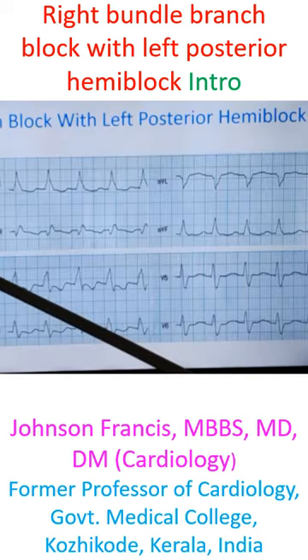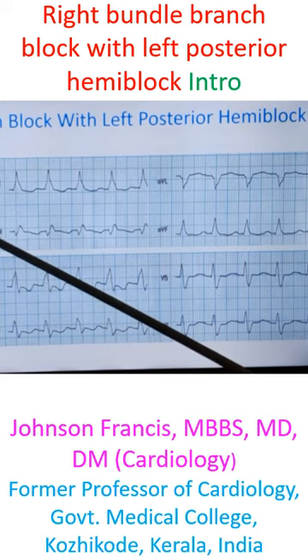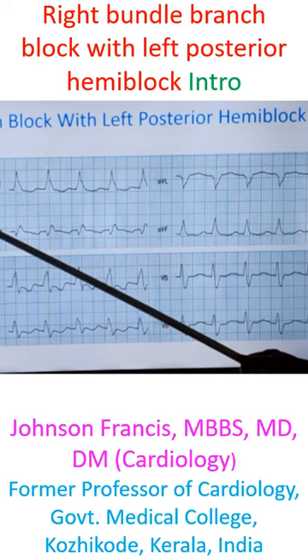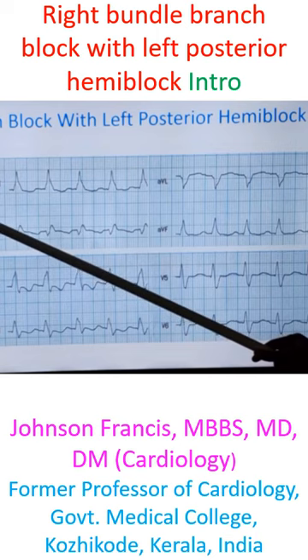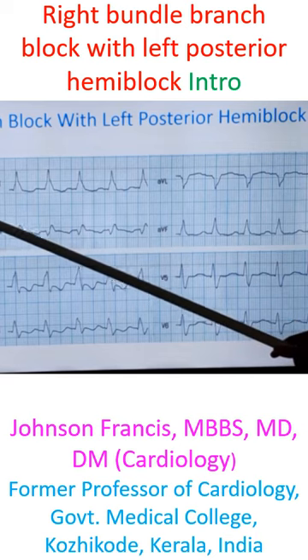This ECG is showing sinus rhythm. You can see P waves — T and P are almost merging together, but you can see the P wave here. This is the P wave, and the PR interval is on the upper limit, almost 200 ms.